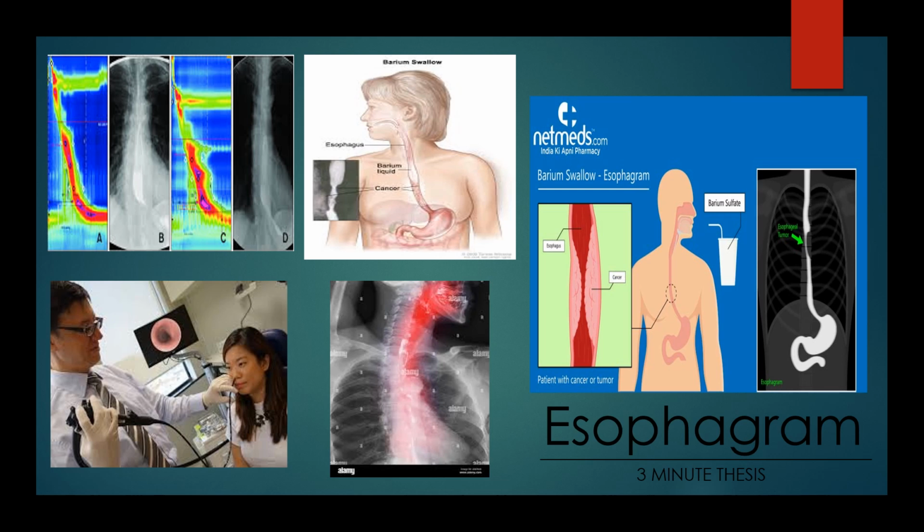Together, esophagram (Barium swallow), HRM, and TNE provide a comprehensive evaluation of the esophageal anatomy, function, and pathology. This multidisciplinary approach improves diagnostic accuracy, guides appropriate management strategies, and ultimately enhances patient outcomes in the management of esophageal conditions.